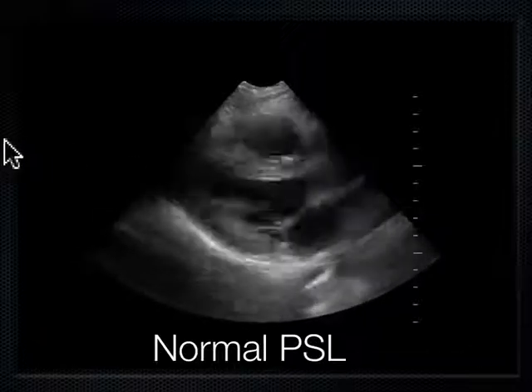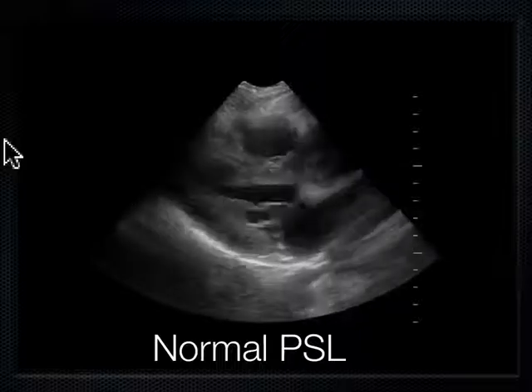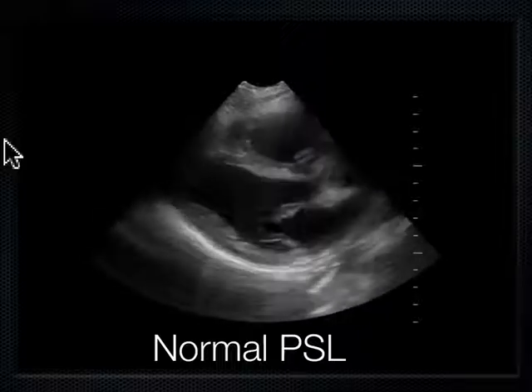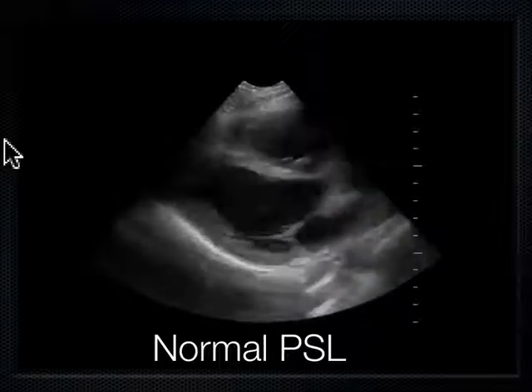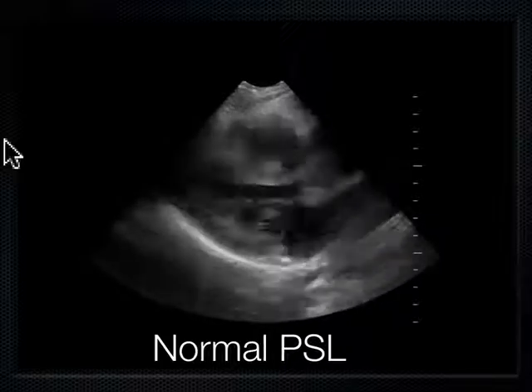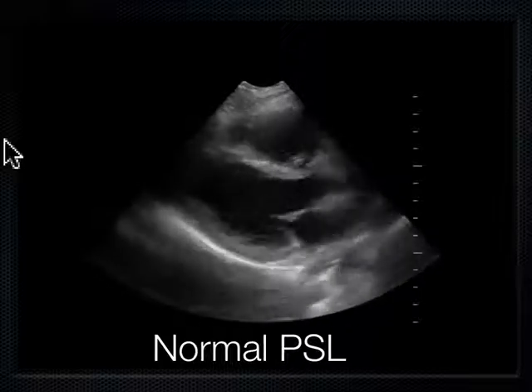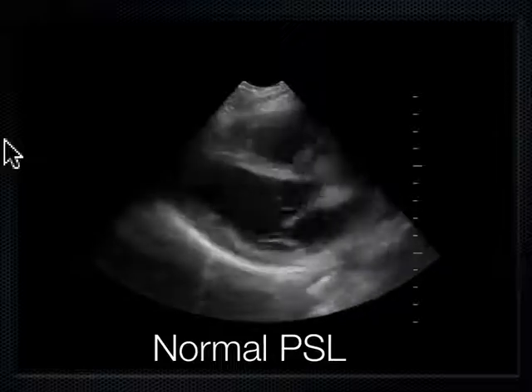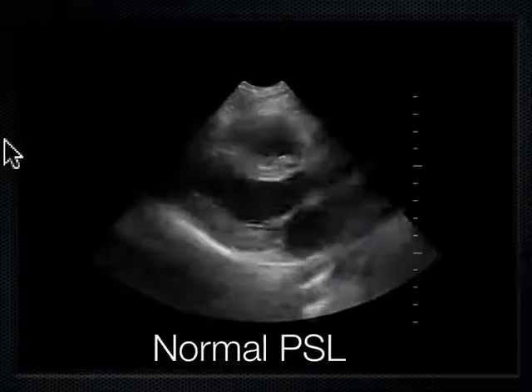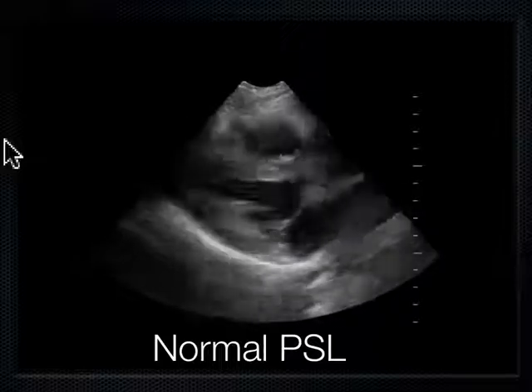And so what I do clinically is, if I have a patient who's got hypotension, I am trying to resuscitate them, and I break hypotensive patients down into, do I give them fluids? So if a person comes in my ER, their blood pressure is 70/40, how do I get their blood pressure back up? I can give them fluids. That's kind of my knee-jerk response. And if I saw a normal functioning left ventricle like this, yeah, I could safely give this person fluids. And that would probably fix their hypotension.